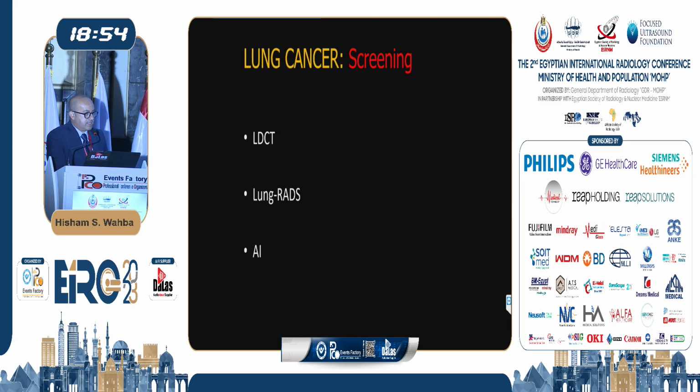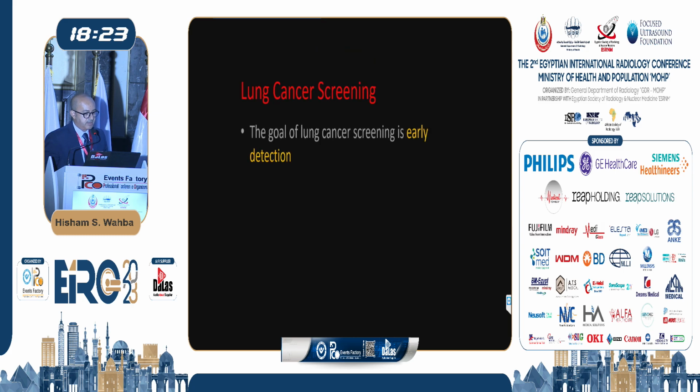Nowadays, we have started lung cancer screening. It started in Egypt 3 or 4 months ago, and we have a large amount of data that will be published soon. All the team here worked with Lung-RADS during the lung cancer screening. The 3 main pillars of lung cancer screening are low-dose CT, which is available everywhere now, AI solutions, with multiple vendors now in Egypt that we're using to aid our diagnostic levels, and the new versions of Lung-RADS.